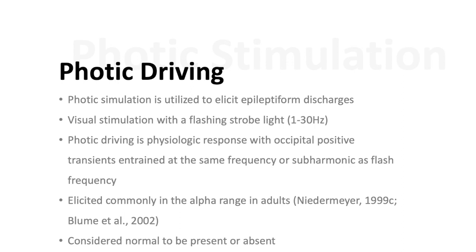Photic stimulation is a common activation procedure typically utilized to elicit epileptiform discharges. We will focus on a phenomenon called photic driving during this segment of normal awake and asleep EEG.